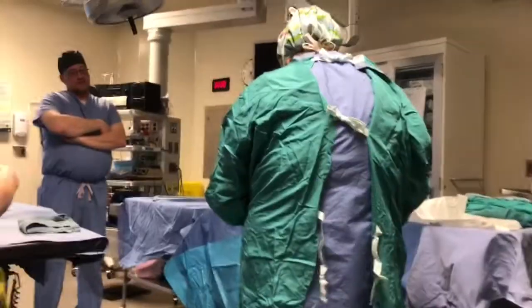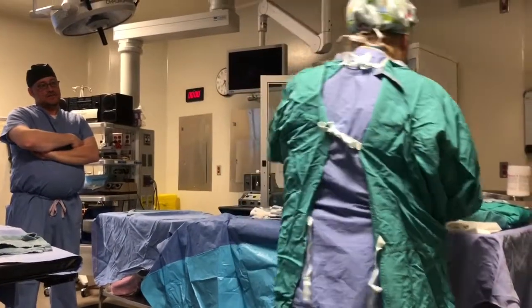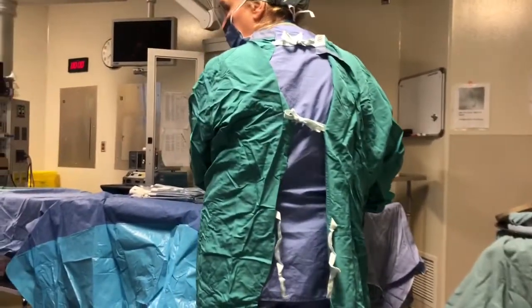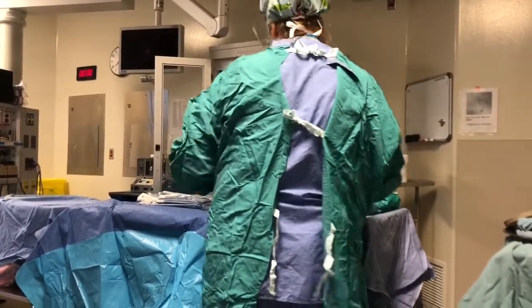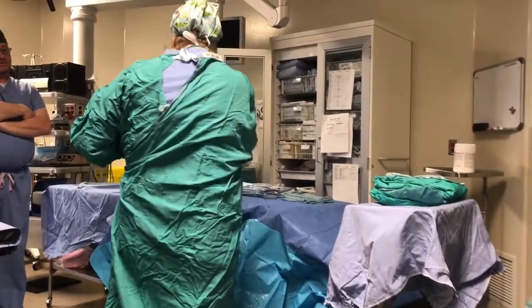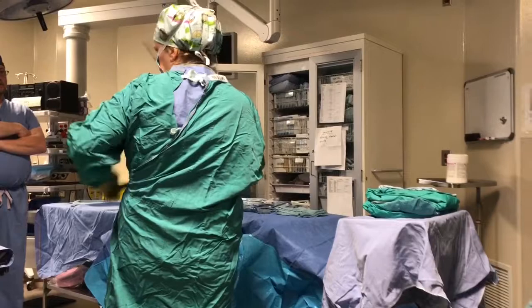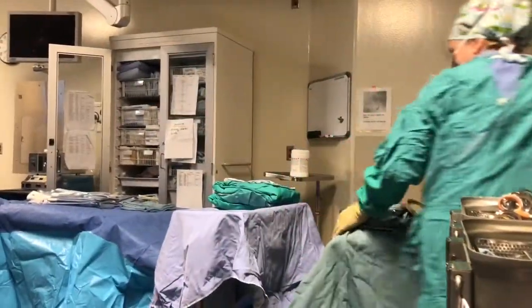Okay, and then remember to turn. Important: keep a hold of it. Don't let it go. Make sure it doesn't stick out the end, because if they go to grab it, they're going to contaminate it. So just plant your feet at your sterile table when you go to turn, so don't flip around. You'll see the little surgeons do a little spinny thing a lot.